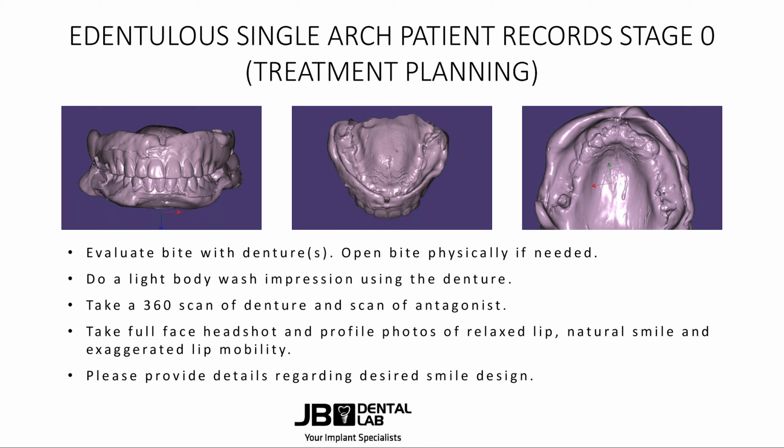When it comes to digital full arch dentistry, it's all about the records. And so we're going to go over pre-op records as well as day of surgery records to see what the designers look for and what you should be looking for with your team when you take these records.